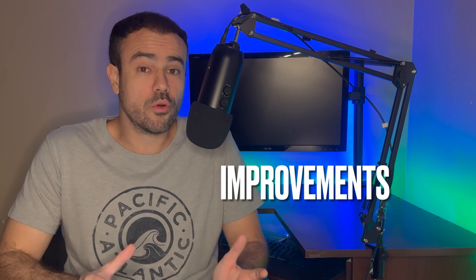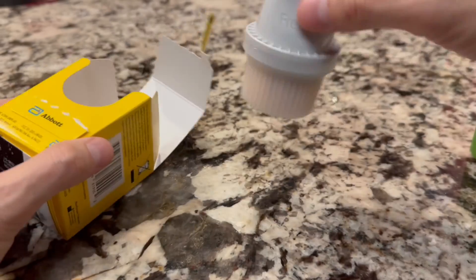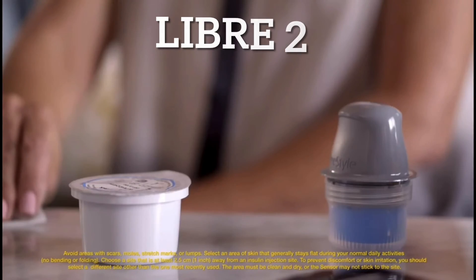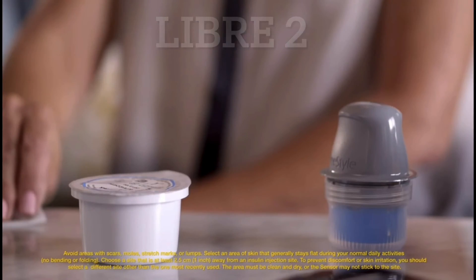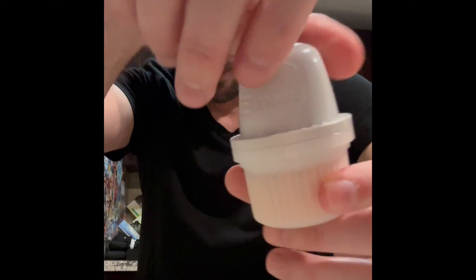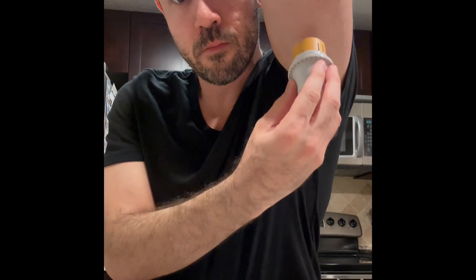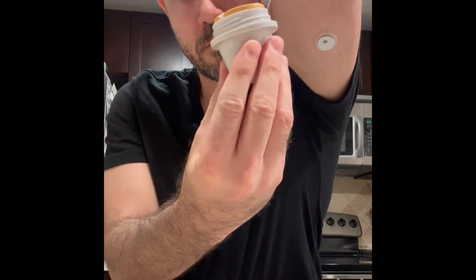As far as putting them on, both are extremely easy and both have improvements compared to their predecessors. The Libre 3 applicator is much smaller, and now rather than being in two separate pieces that need to be assembled like in the Libre 2, it comes pre-assembled in one simple one-piece applicator. To apply it, all you do is unscrew the cap, clean the arm with a bit of alcohol, then push down on the applicator, and you're done. Super easy.